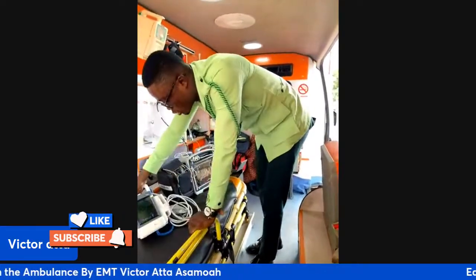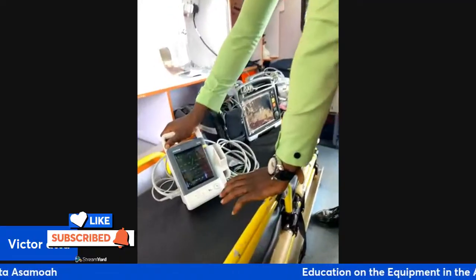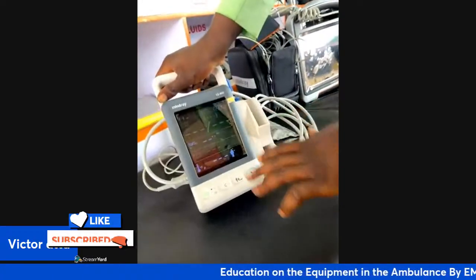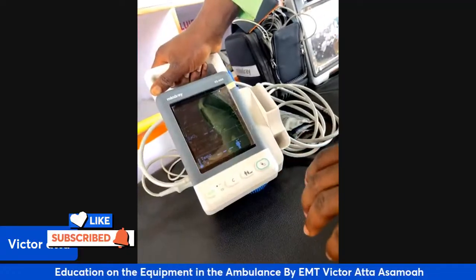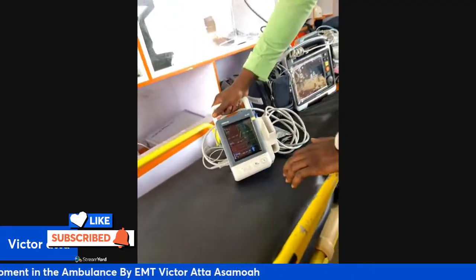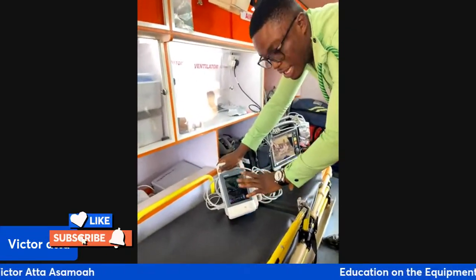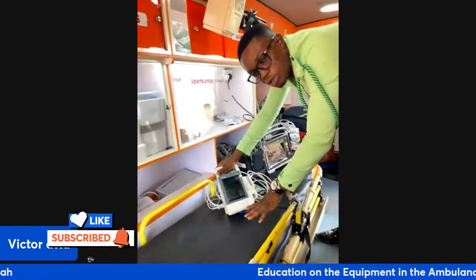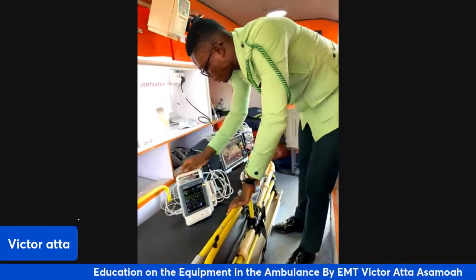So this small monitor allows you to see only the BP, the SpO2, the pulse rate, the temperature, and the PI, the perfusion index.